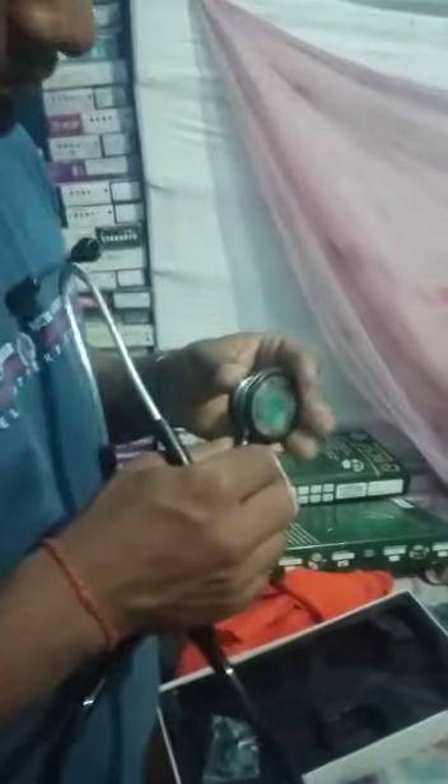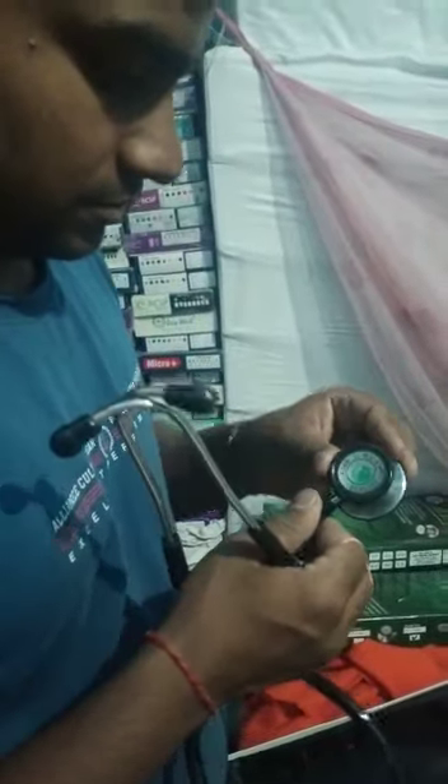This is making a diaphragm. Now we are checking the chest piece. Now we will see how it will be fixed. Now we are looking at this.